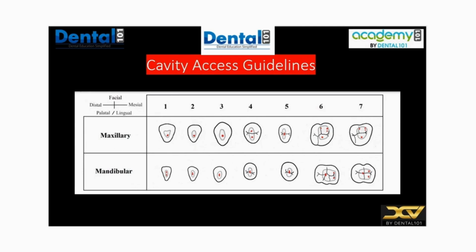Now we know we've had a few surprises, so you can use this last slide as a guide to help us with any tooth that comes up so that there's no surprises. So this is the shape for your access cavities for your upper maxillary from the 1st to the 7th tooth. And this is the shape of your mandibular access cavities from the central to the 2nd molar. And you can use this to go about if any tooth comes.